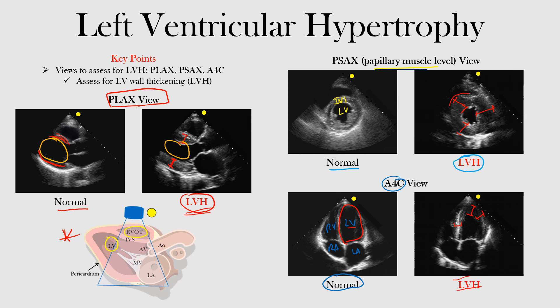Notice the walls are much thicker on the side showing left ventricular hypertrophy. The cavity is actually much bigger over here on the normal side compared to this region showing LVH. Notice the thickening of the left ventricular walls — that's what you're really looking for.